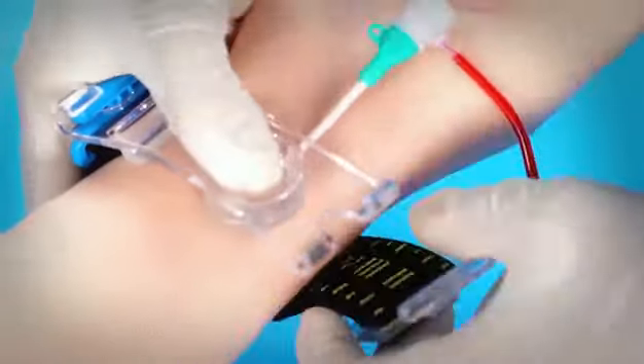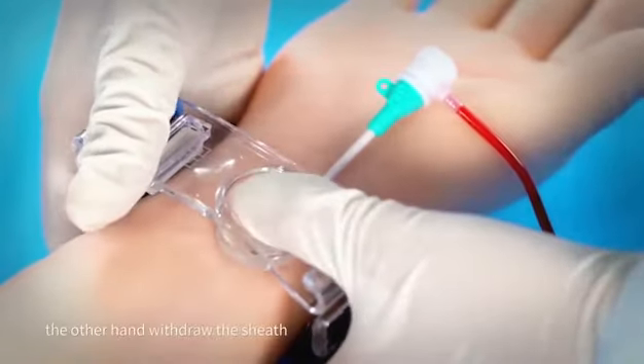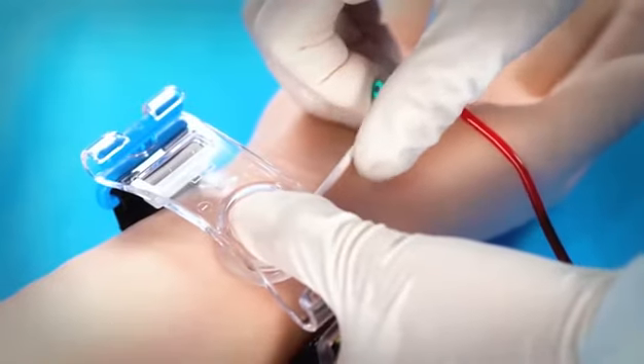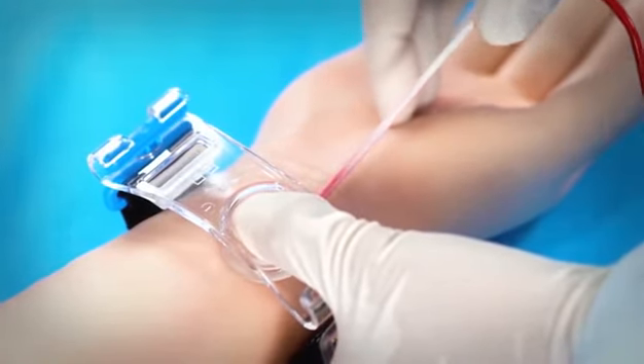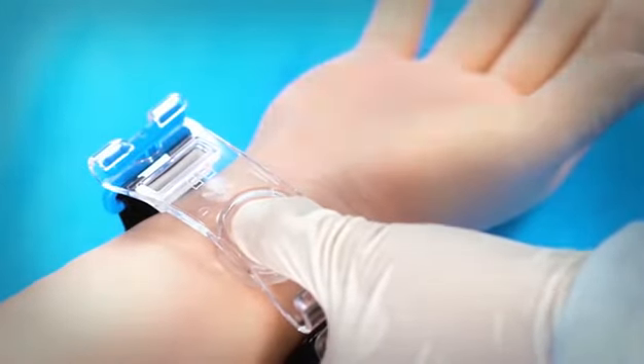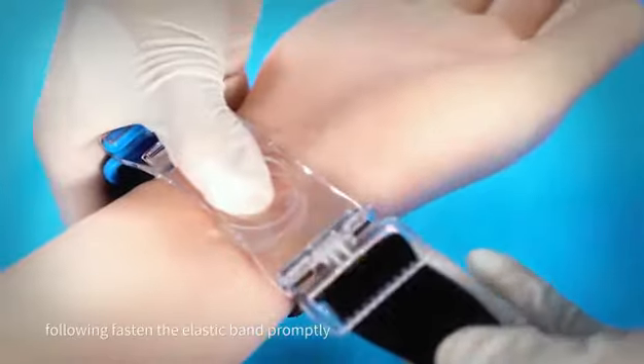Coordinate with two hands: one thumb presses the groove to fix the force pad, while the other hand withdraws the sheet. Following this, fasten the elastic band promptly.